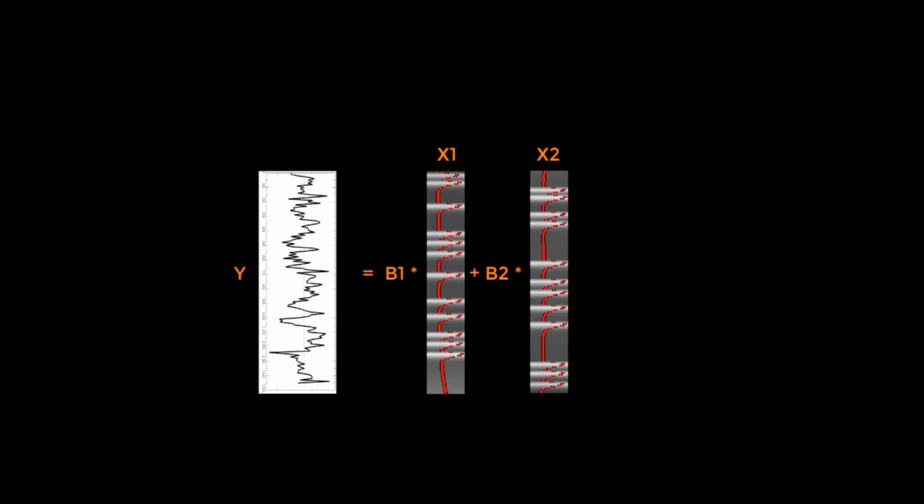Yeah, I was getting confused with dummy coding, where at this time point this is 0, the other one is 1, and vice versa, to make sure that we are just canceling out one beta over the other one. But now it does make sense. Right, we're not necessarily doing dummy coding in the sense you were saying.